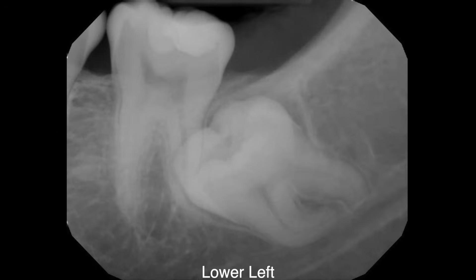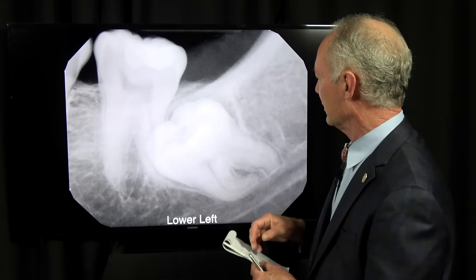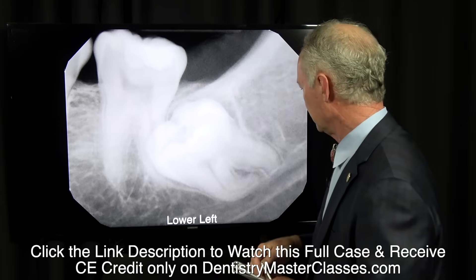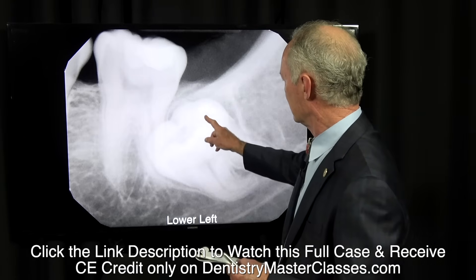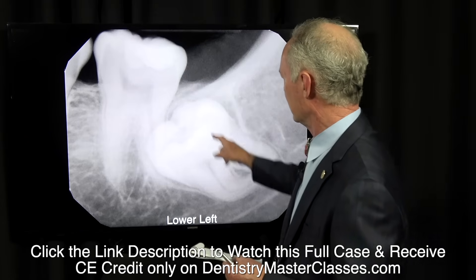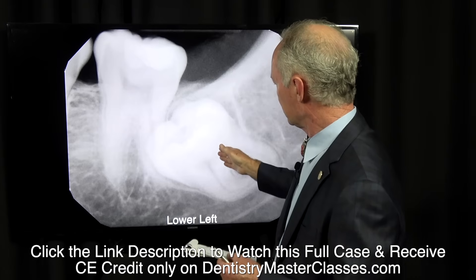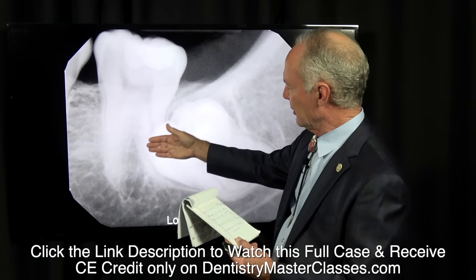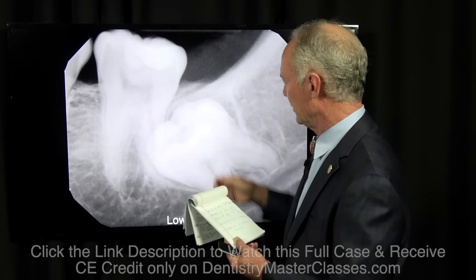So let's talk about what makes this wisdom tooth such a difficult extraction. Getting access to section this tooth was very difficult because of the second molar. Getting a handpiece in here to section it was complicated because when you section the tooth, you want to section to the furcation — and you see the angle. You'd like to section the tooth straight through the coronal part of the tooth to the furcation. In this case, I had to section in the distal part of the crown, because the mesial coronal part of the crown was actually on the facial aspect of the second molar, just making it so difficult to get to and so difficult to elevate.